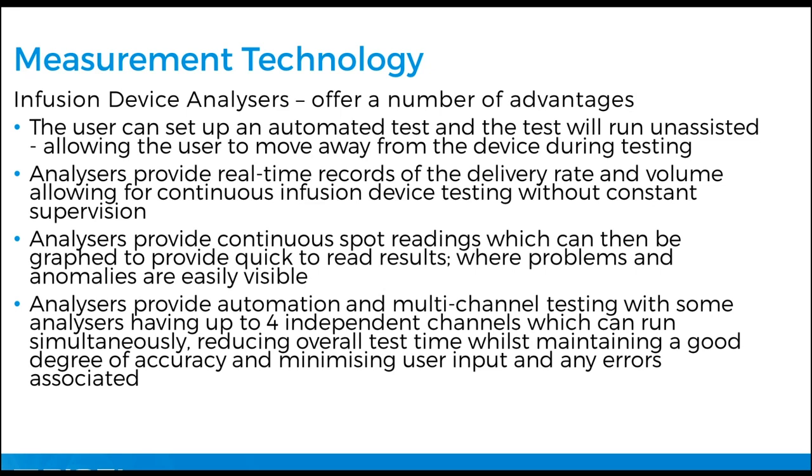So analyzers provide that real-time record and delivery rate and volume rate to give you this continuous infusion device testing without the constant supervision. The other methods all need some kind of constant evaluation, or require much more manpower, whereas the infusion device analyzer doesn't.